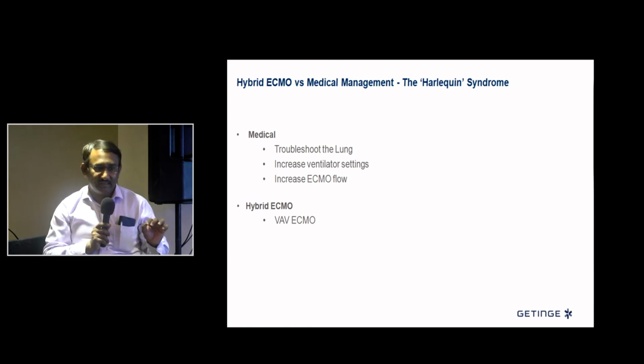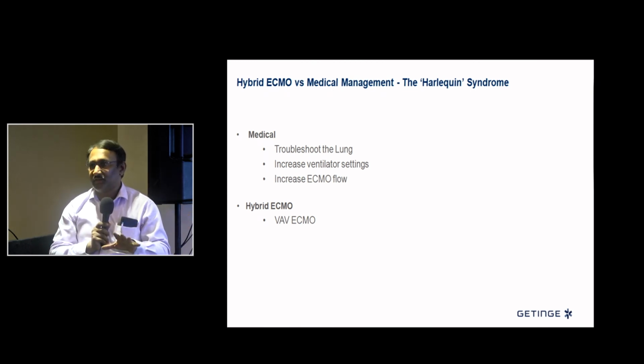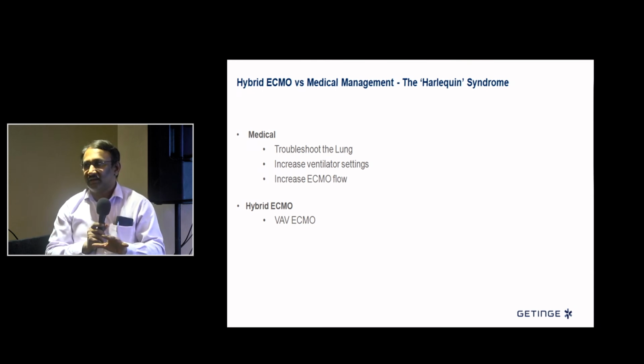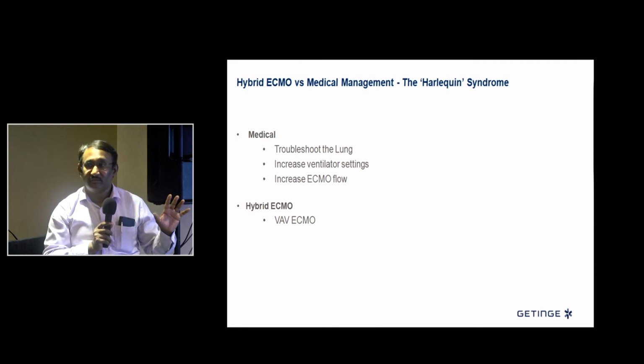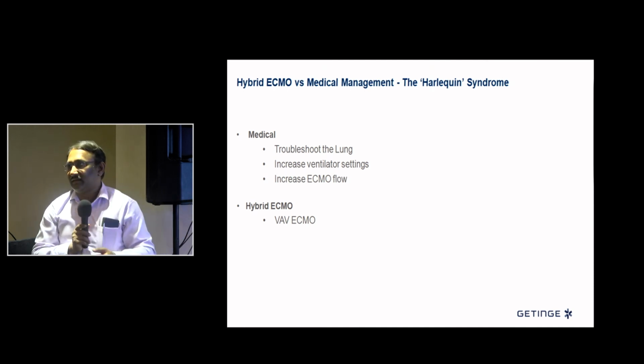If your patient is awake, whether awake on ventilator or totally awake, you see them first manifesting with a lot of confusion, restlessness, irritation. That's how you know that there may be an issue. That's where you start diagnosing or looking for this particular problem. So how do we approach this? What are the ways to handle this? First, can anyone say quickly?